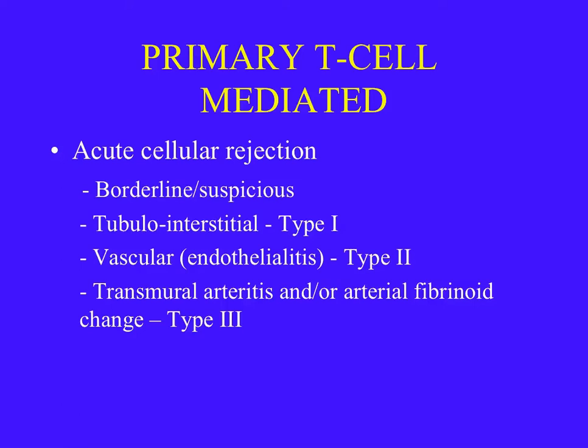The difficulty with acute cellular rejection is that there is a huge variation histologically, from no cellular infiltrate to marked widespread inflammation of the cortex, which makes it extremely difficult for the pathologist to decide between a significant immunologic response that causes renal dysfunction, and therefore requires treatment, and a clinically insignificant cellular infiltrate. This is the reason why the borderline suspicious category in Banff and its clinical implications still remains nowadays a grey, debatable area.